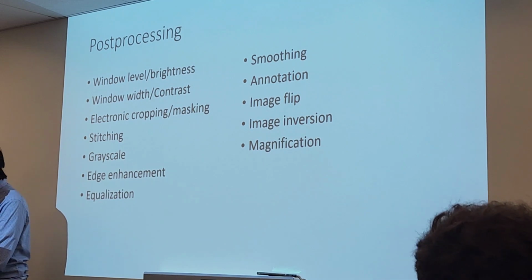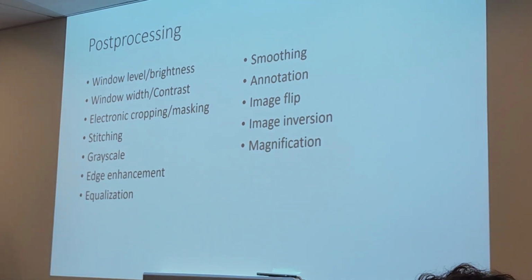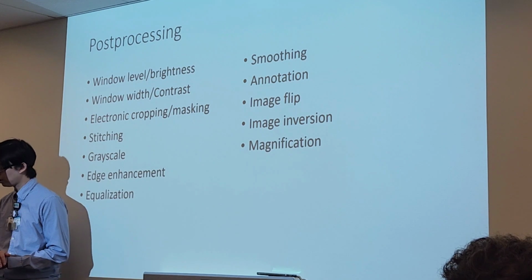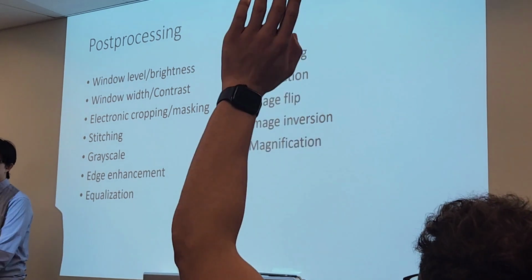That's right. Fortunately, we've hit a pretty good stopping point. We were able to get through all of our pre-processing techniques, right? We got through automatic rescaling, flat field correction, and dead pixel correction. And then we had a chance to talk about dynamic range and exposure latitude. So any questions about what we've talked about?